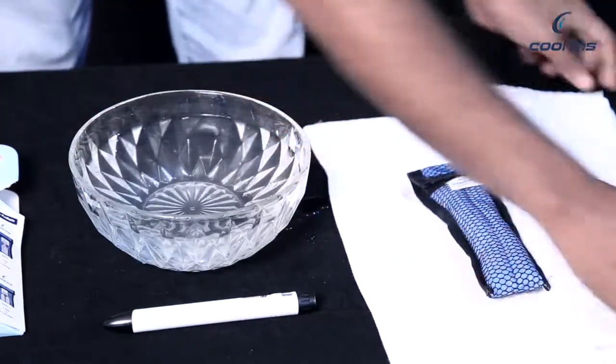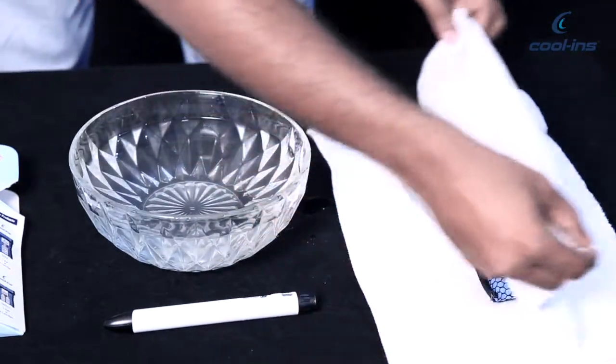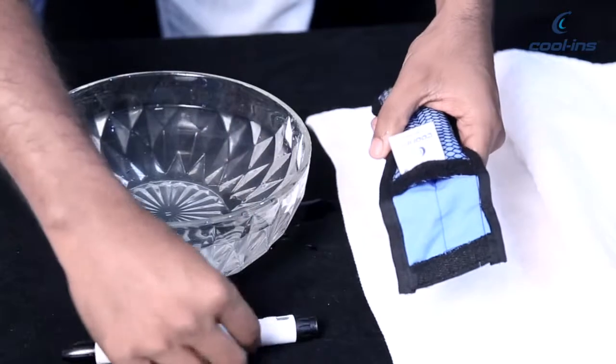Later, you can dry it with a towel. You can now insert the medications inside the pouch and it is ready to go.